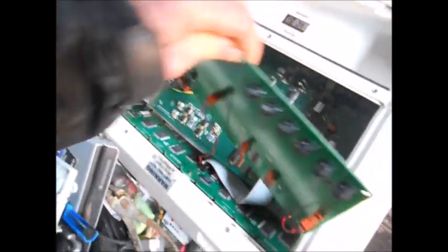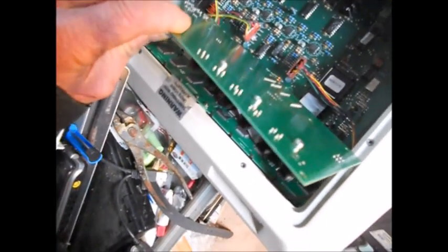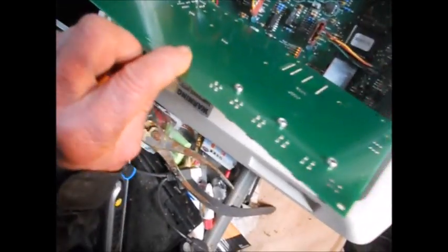Underneath this plastic thing, there's going to be like five screws that hold this basically together. There's two screws on this board. No, there's the five screws here. And then there's two screws on the bottom board that hold it in place.